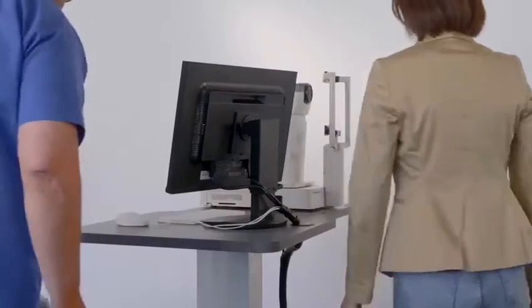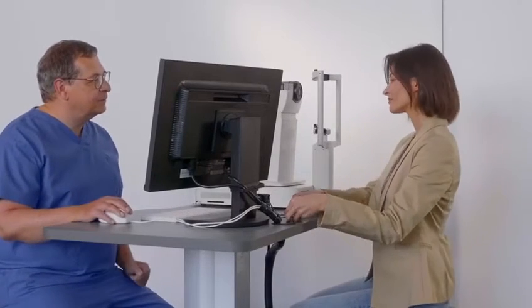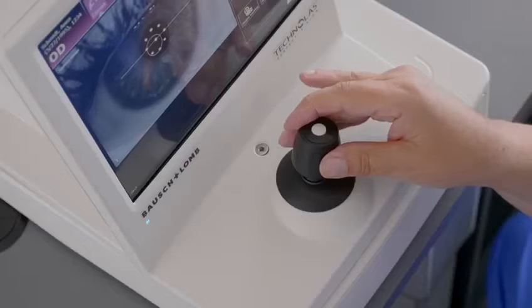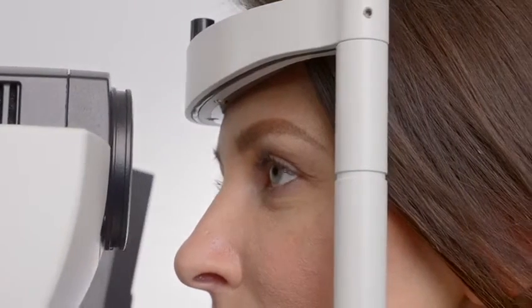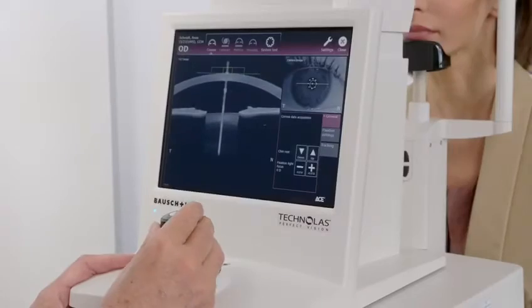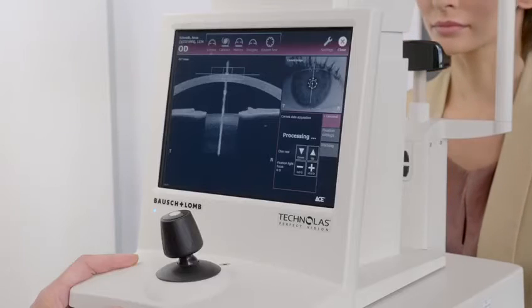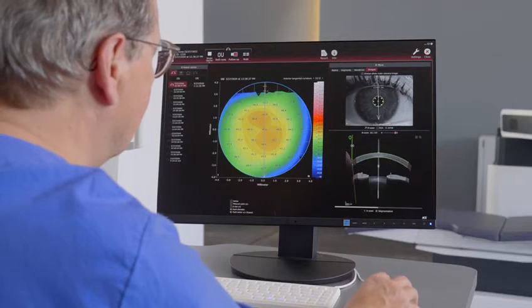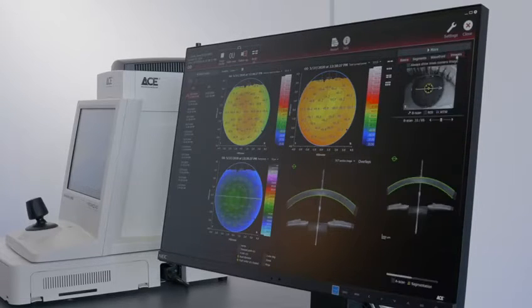ACE is a platform that brings together corneal topography and tomography. It optimizes preoperative data to provide more information to help select a suitable laser treatment and utilizes the power of high-resolution swept-source OCT. Its speed of acquisition enables the new ACE to display up to six maps simultaneously, compare OD and OS, or perform an analysis over time. ACE selects from 12 different map types and delivers an OCT-based cross-section of the eye.